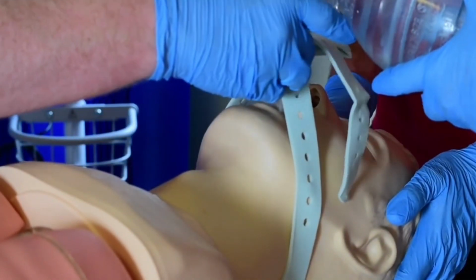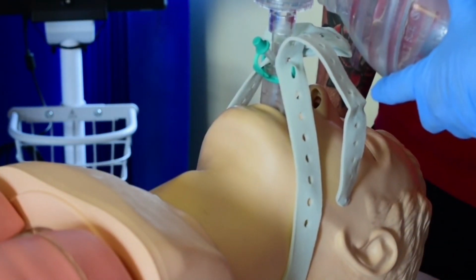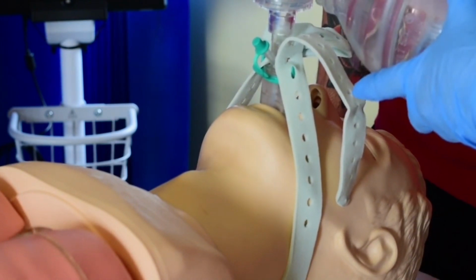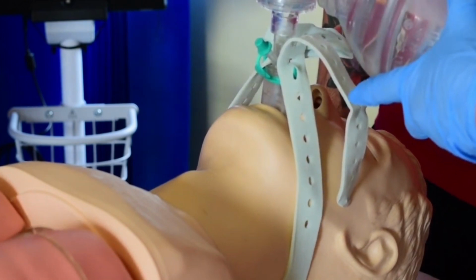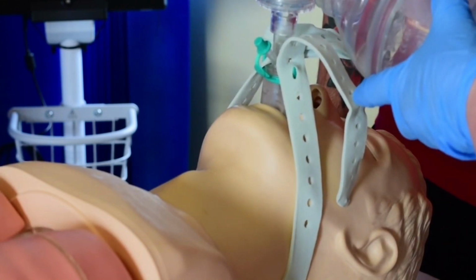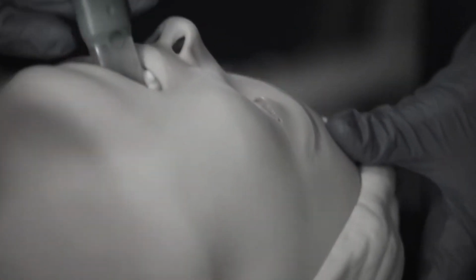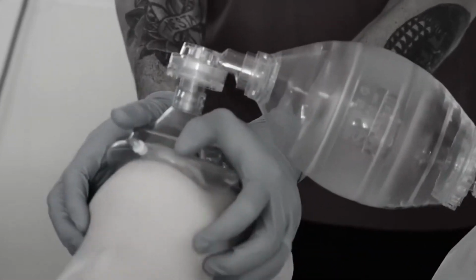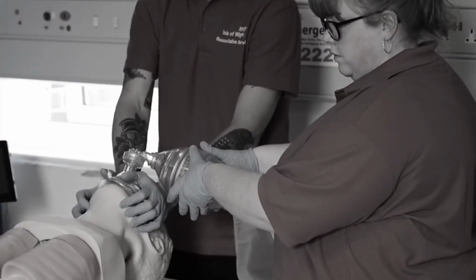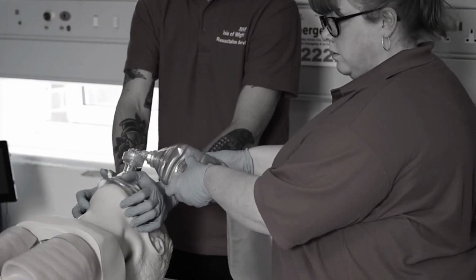If the device provides a sufficiently good seal, immediately secure it with the strap included. If the device has a large leak, briefly attempt to insert it deeper with gentle pressure, observing the maximum depth line. Try not to let the device rotate or migrate to one side of the mouth. If the leak does not reasonably improve with repositioning and is not providing adequate ventilation, consider removing the device and returning to a combination of techniques and adjuncts that previously worked well, and reassess ensuring expert help is on the way. Multiple prolonged attempts at reinsertion traumatize the airway, complicating further management and distract rescuers from administering adequate ventilation and oxygenation.